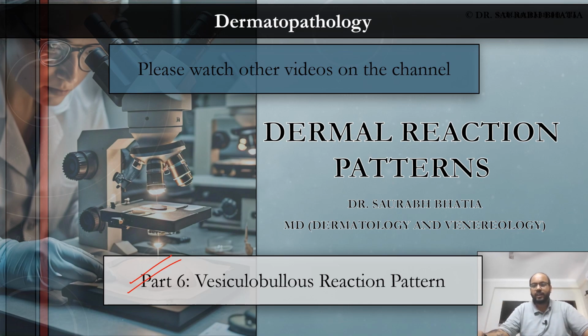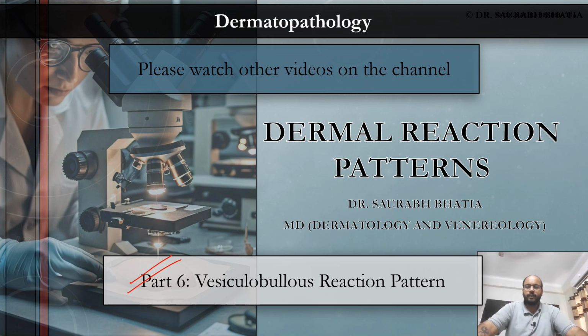Now, last week we were studying spongiotic tissue reaction pattern, and we know from that spongiosis is somewhat of a finding that can be seen in a lot of different disorders. One of them being vesiculobullous reaction pattern. Formation of all vesicles will start from some bit of spongiosis, okay? And when the spongiosis crosses a threshold, it will become larger and become a vesicle. And if the vesicle becomes larger, it becomes a bulla. That's why it's vesiculobullous reaction pattern, okay? So whenever a vesicle is trying to form, it will go through stages of spongiosis, vesicle, and bulla.